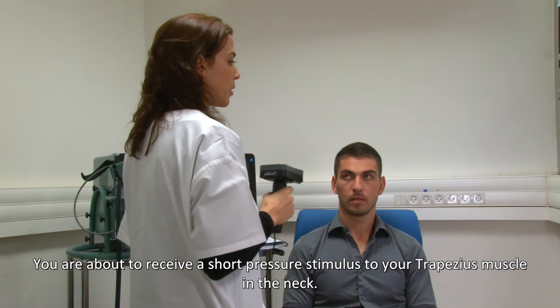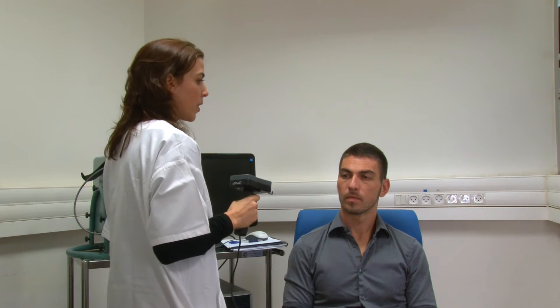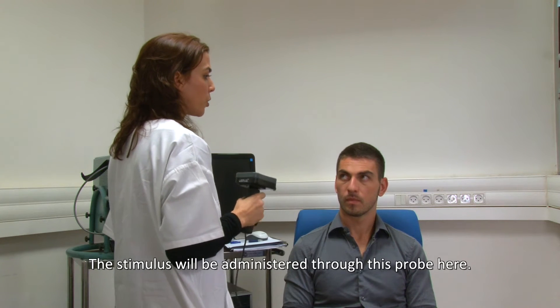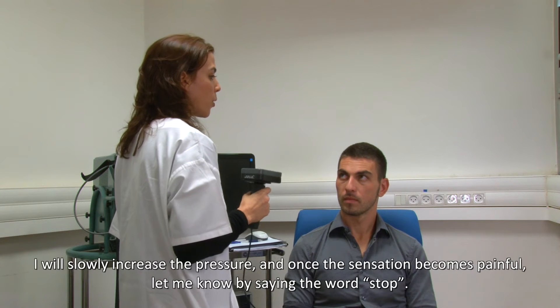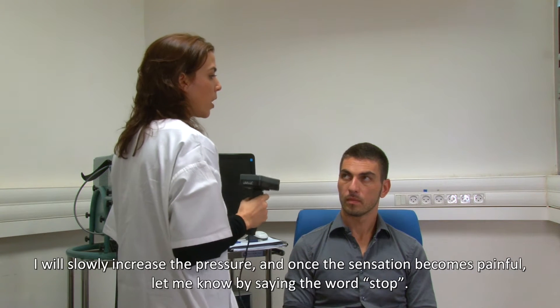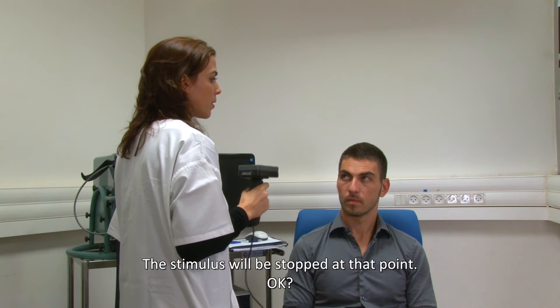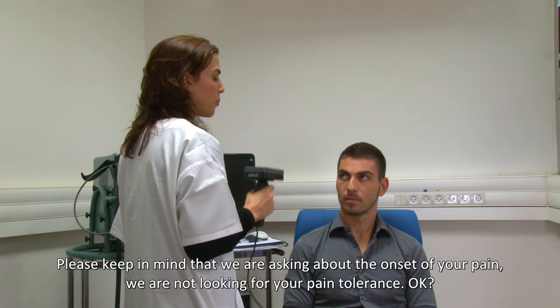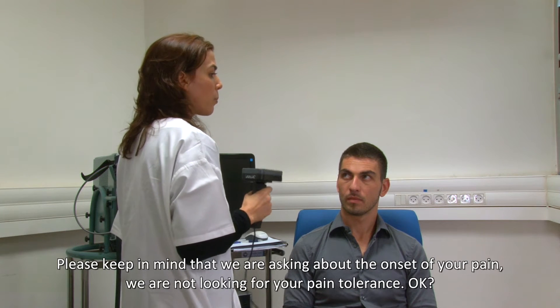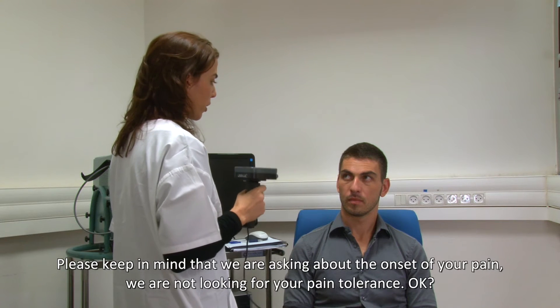You are about to receive a short pressure stimulus to your trapezius muscle in the neck. The stimulus will be administered through this probe here. I will slowly increase the pressure, and once the sensation becomes painful, let me know by saying the word "stop." The stimulus will be stopped at that point. Please keep in mind that we are asking about the onset of your pain — we are not looking for your pain tolerance.